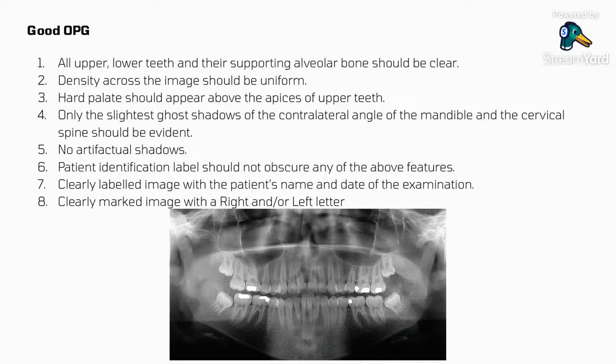Then the patient identification label should not obscure any of the above features. It should be clearly outside the radiographic image. Okay. And the image should be clearly labeled.